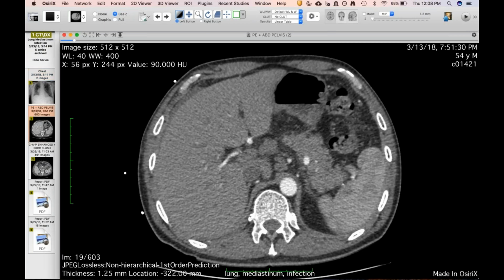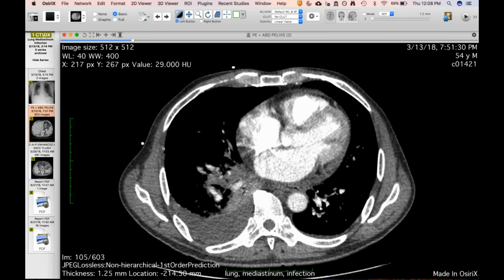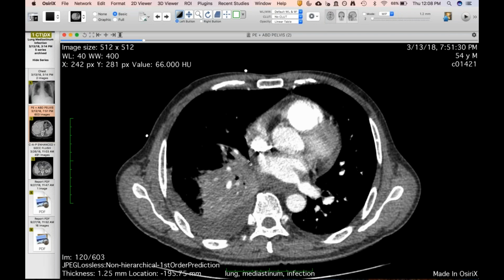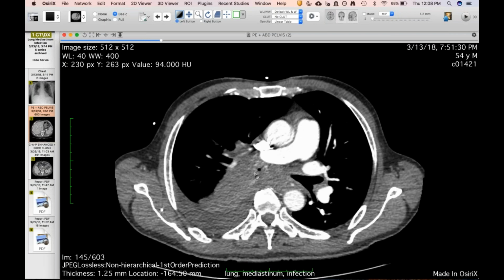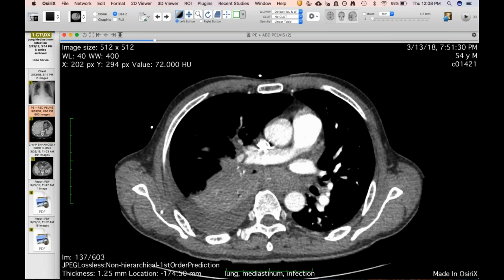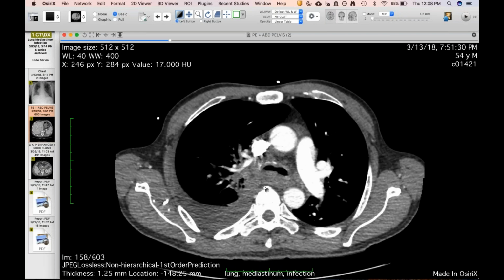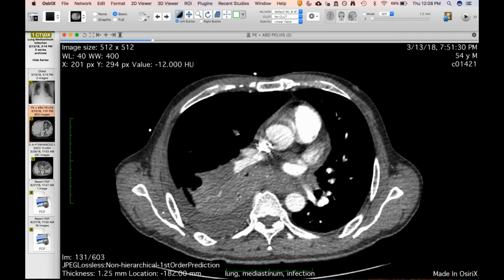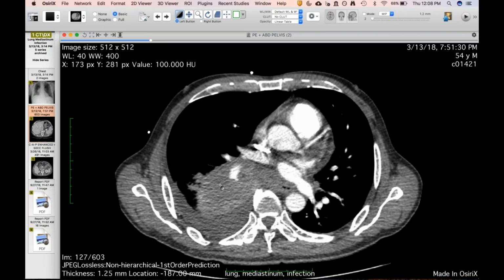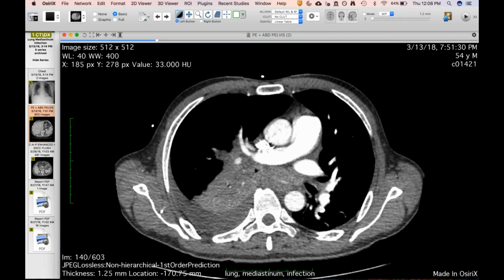And so he had a few weeks of worsening symptoms, cough, night sweats, B symptoms. And this is another one. This was done at an outside hospital and transferred in with a presumptive diagnosis of cancer. That this was all called mass. And I don't disagree with that in the sense it looks like it could be, except some of the features we often see when you have a big mass are displacement of vessels, like the mass taking up space, pushing things out of the way.